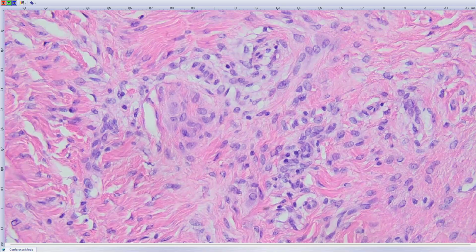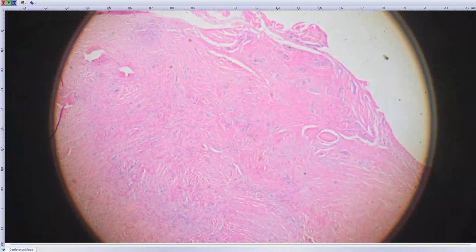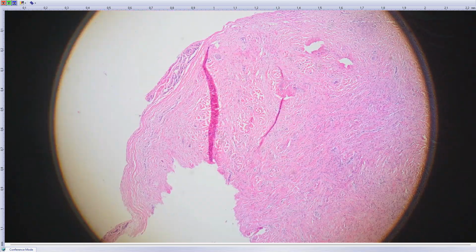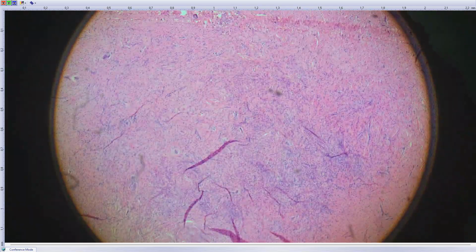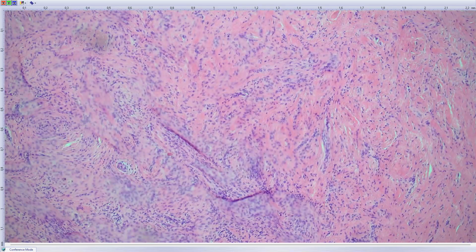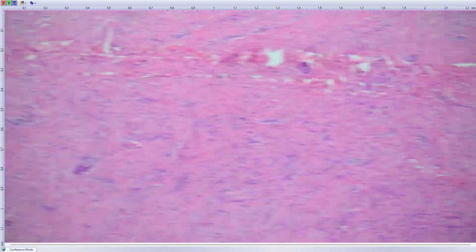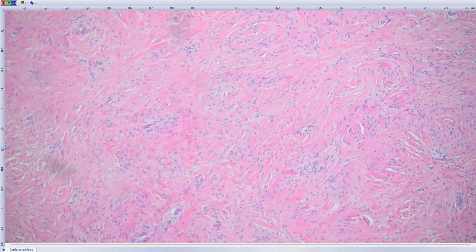Also here, again, large epithelioid cells. So again, from H&E, this is, I think, very hard to impossible to diagnose, so you need some immunohistochemistry. Look at the other section. There's perhaps more of these large epithelioid cells, but this slide is dirty, so it's hard to see.